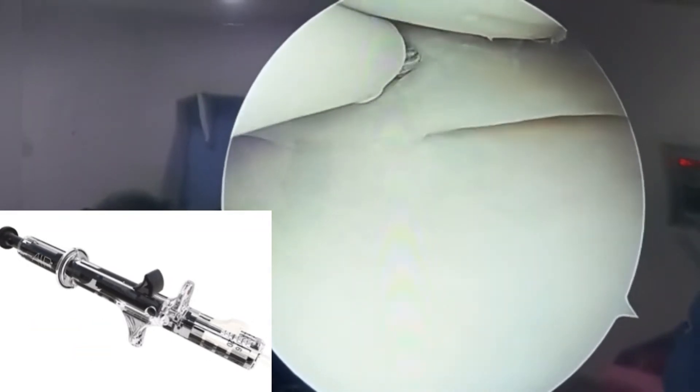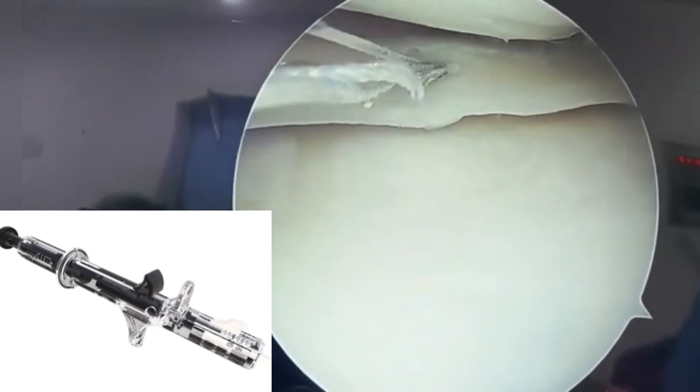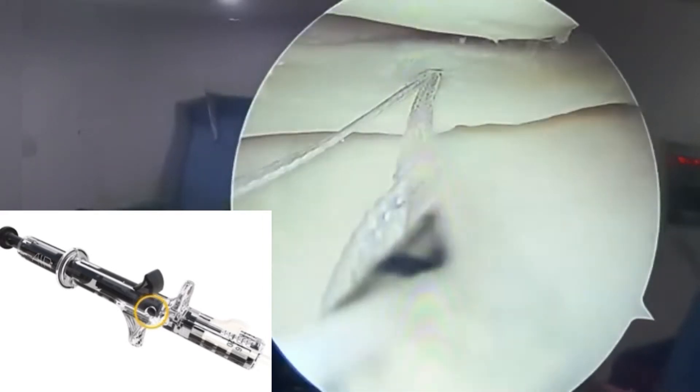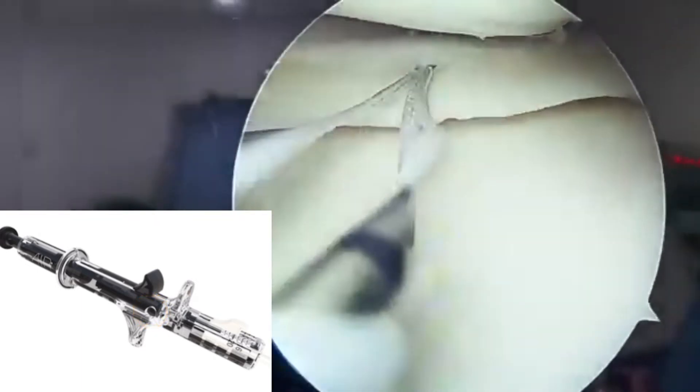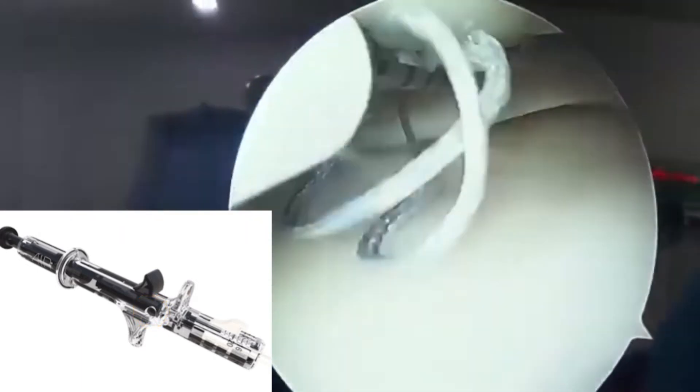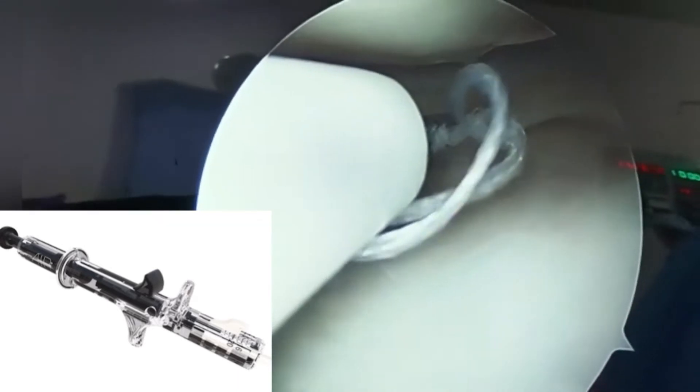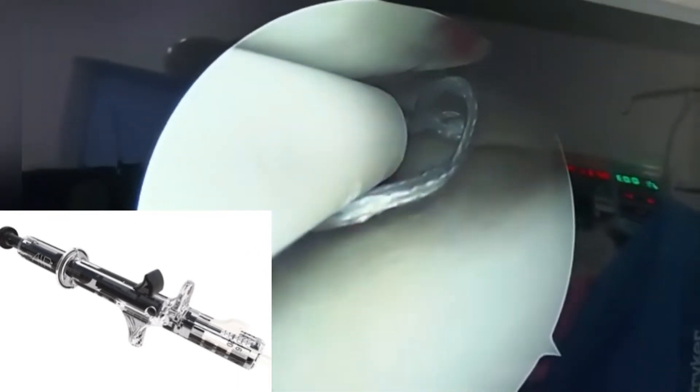When implanted, you'll feel tactile feedback. You'll hear an audible click, and you'll observe a positive indicator in the anchor deployment window. This active deployment feature is designed to ensure implants deploy only when intended, in order to minimize the risk of misfire.